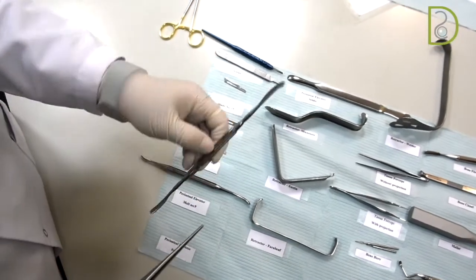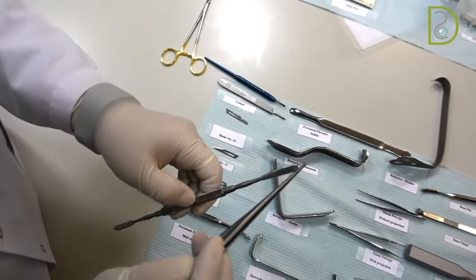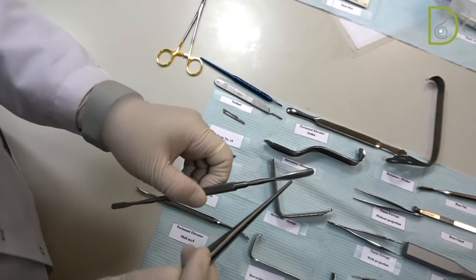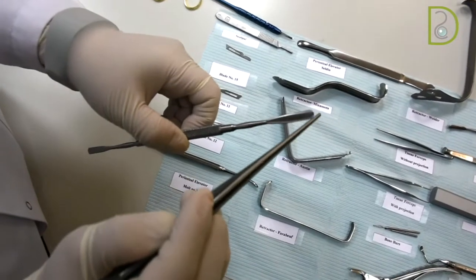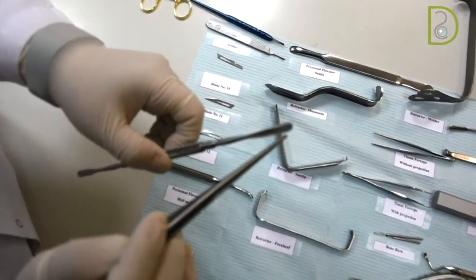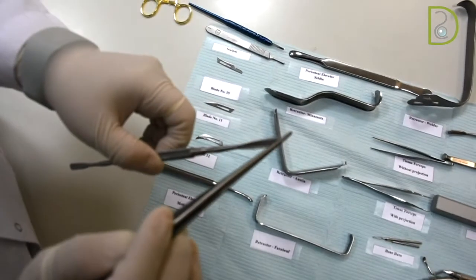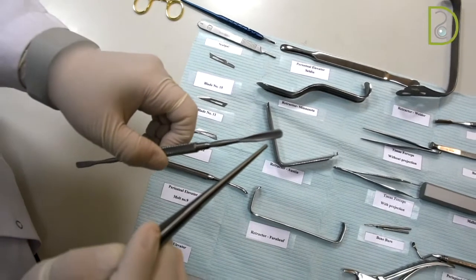This is Freer. It looks like the spoon shape on Molt number 9, but it is an even finer design and even smaller in diameter. And this is good to reflect the gingiva from around a tooth before extraction.